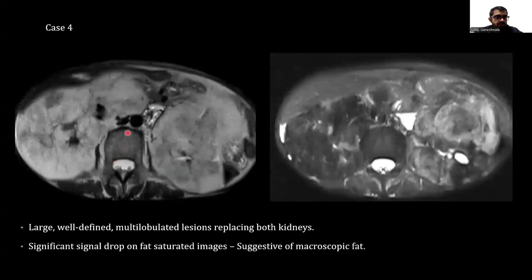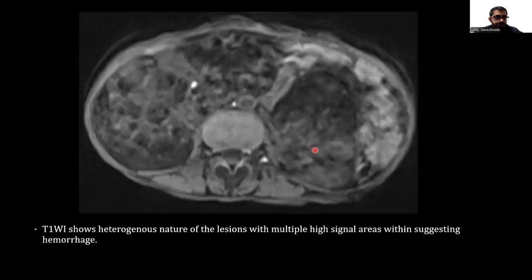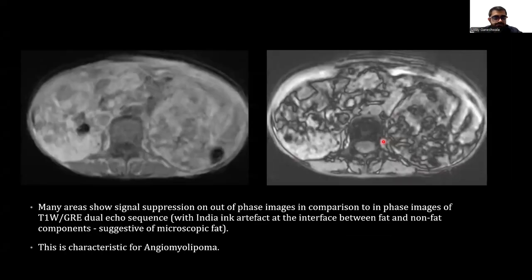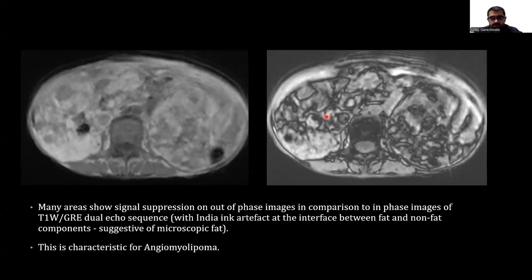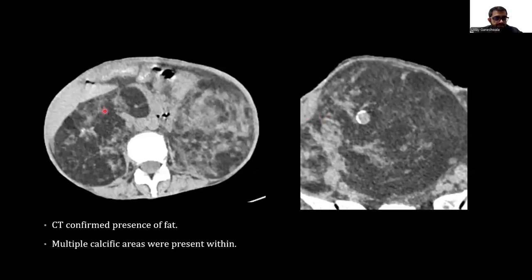We can see large well-defined multi-lobulated lesions replacing both kidneys. Significant signal drop on fat-saturated images was noted, consistent with macroscopic fat. T1-weighted images show heterogeneous nature of the lesion with multiple high signal areas within suggesting hemorrhage. Many areas show signal suppression on out-of-phase images compared to in-phase images of T1-weighted GRE dual echo sequence, with India ink artifact at the interface between fat and non-fat components suggestive of microscopic fat. This is characteristic of angiomyolipoma. CT confirmed the presence of fat and multiple calcific areas within.